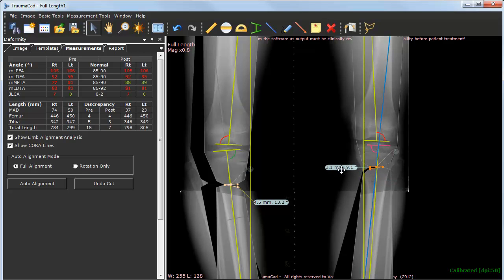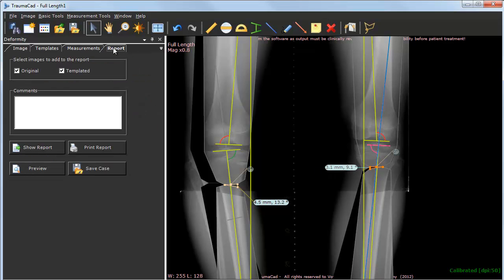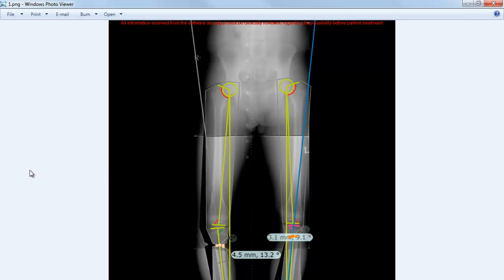Also, you may go to the Templates tab to add templates to the planning. Once you feel the planning is completed, you can go to the Report tab to preview the image that will be saved or committed back to the PACs system.